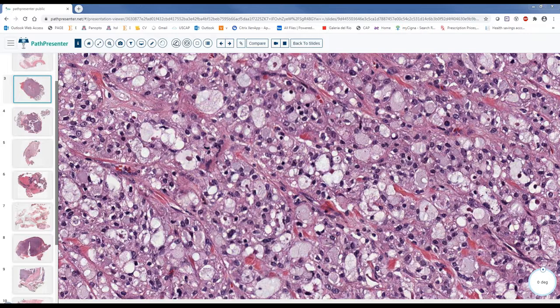All right, good. So secretory carcinoma, the importance is to see that it is not an acinic cell carcinoma. One thing to say, again, it is well circumscribed, but it is malignant nonetheless. So be careful with that. All right, so what immune stain would you like to order to say this is not an acinic cell carcinoma?